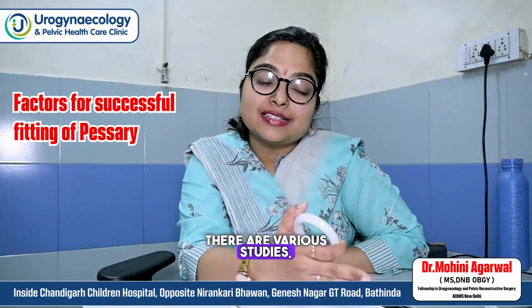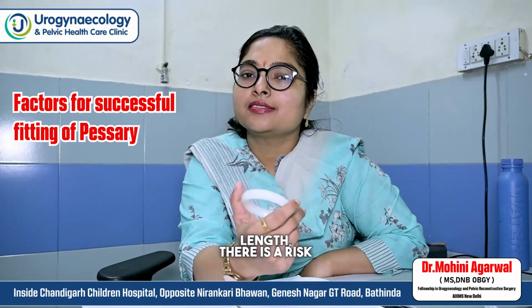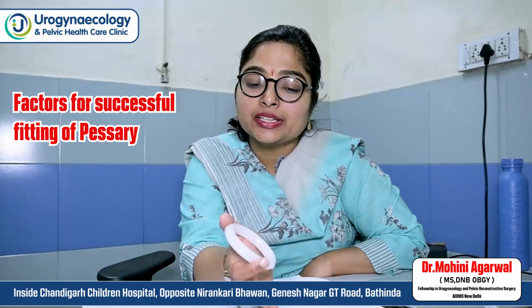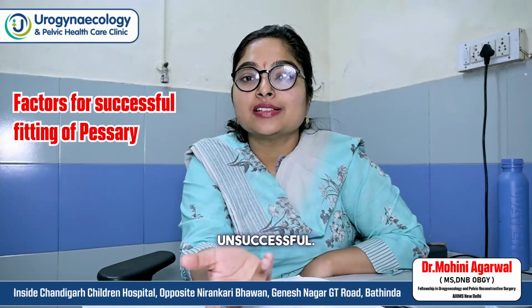Then total vaginal length, TVL. There are various studies in the literature, some say less than 5, less than 6, less than 7. So basically, short total vaginal length is a risk factor for the pessary not fitting well. That is one thing. Introital diameter more than 4 finger breadths: if the introital diameter is wider, there are chances of unsuccessful fitting.